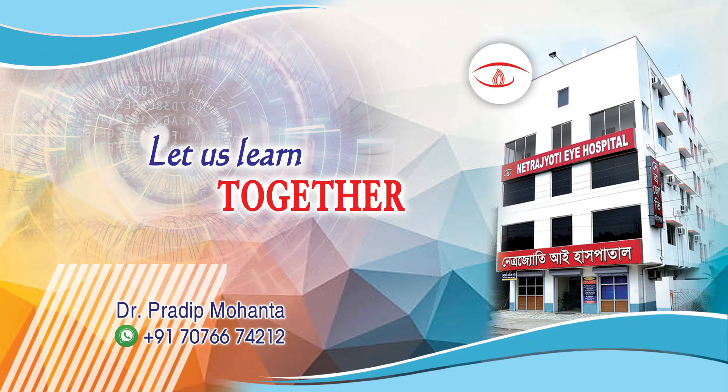Dear colleagues, welcome to my workplace at Ranakh Heart, West Bengal, India. Let us see this routine phacosurgery.